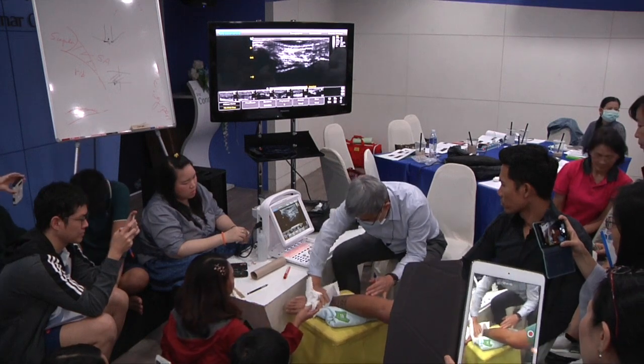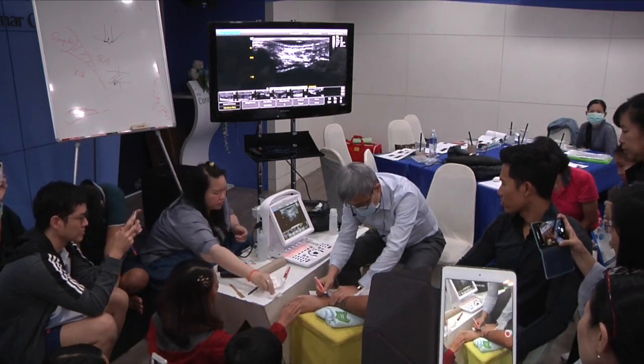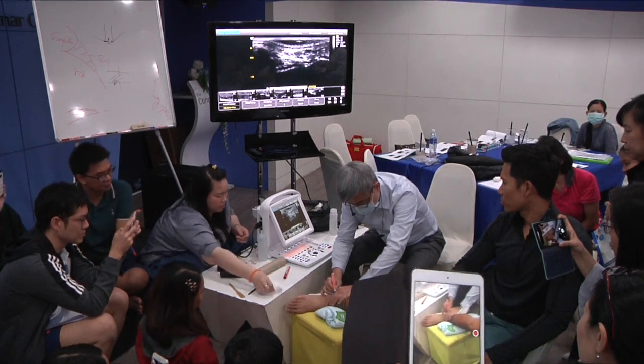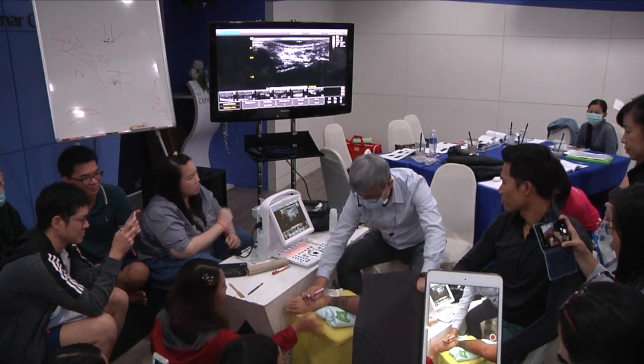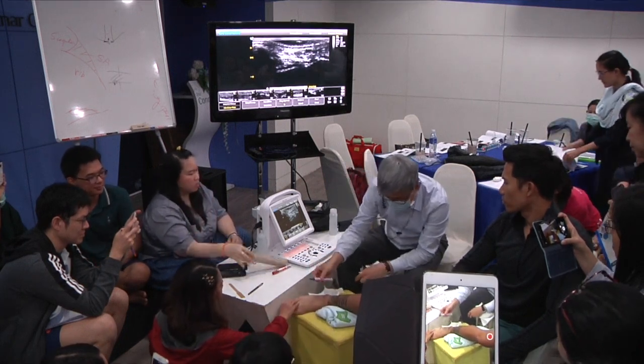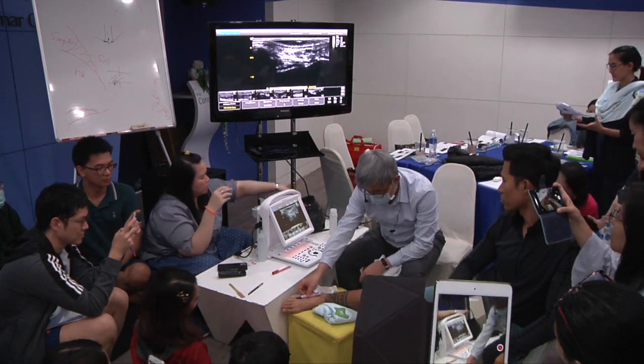Good. Cool. Do you think about that? Do you consider making some tattoo about anatomy next time? Okay, side line. Yeah, straight. Toe to the right. Right.